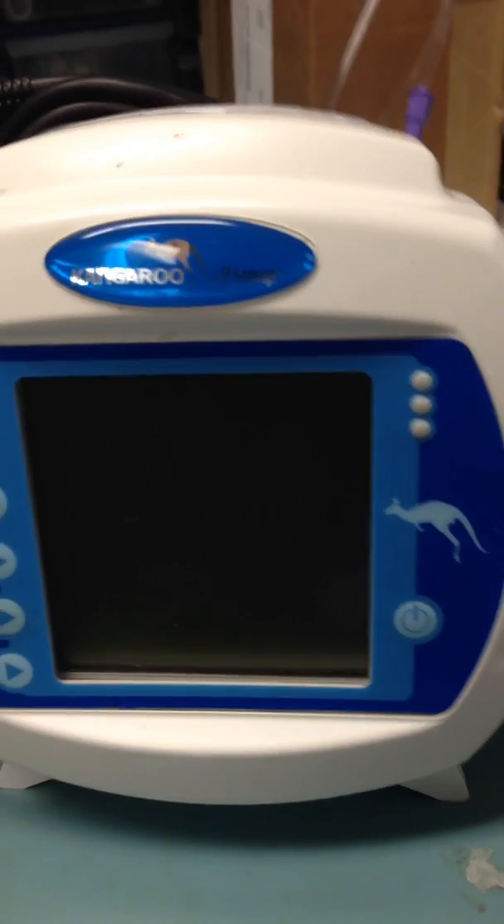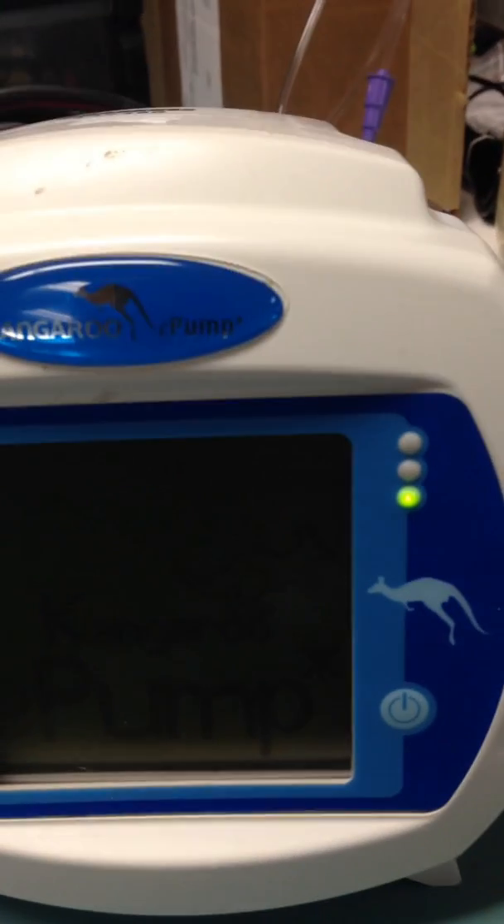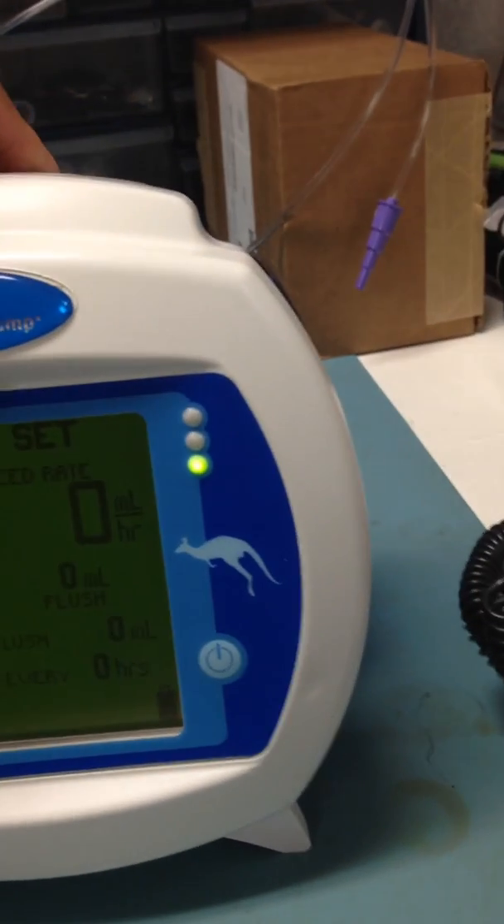This is the Kangaroo feeding pump. Turn it on. This side of the feeding pump is where the sensor board is. This is the rotary — this is where the feeding pump feeds the patient.